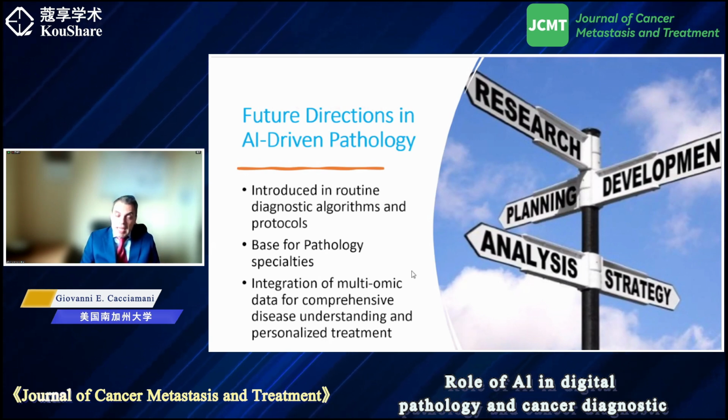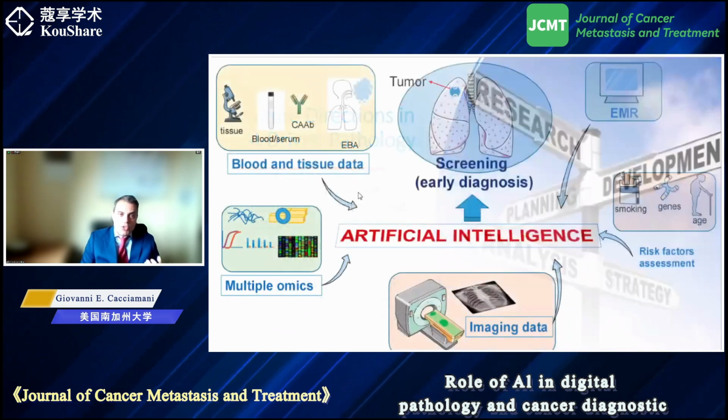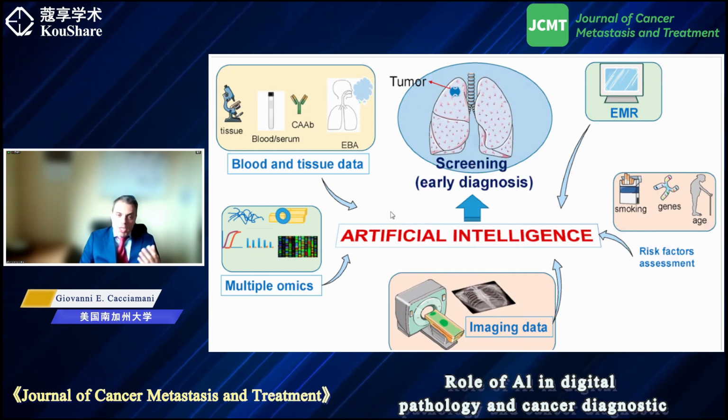But telepathology would allow any center to have a consultant for a very specific field of disease, in pathology like neuropathology, hematopathology, and so on. So I think this would be one of the major applications of digital pathology. And quite relevant, it will not be only a matter of pathologists, because artificial intelligence promises to integrate the multiomics, so that whatever we get from blood, genetic analysis, what we get from the clinical setting, radiology and clinical evaluation will be put together with the pathology investigation in order to improve our diagnostic capability.